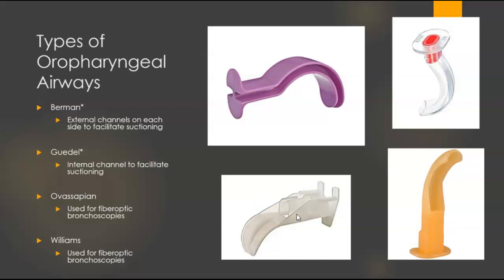We use bronchoscopies to take a deep look down into the patient's lower airways. They can do it therapeutically to like remove secretions or mucus plugging. Or sometimes they use it if there's a lot of pulmonary bleeding, they'll go down there and cauterize or put pressure on the bleeding to help stop the bleeding. So those are examples of therapeutic bronchoscopies.